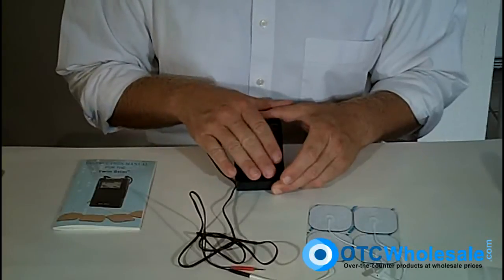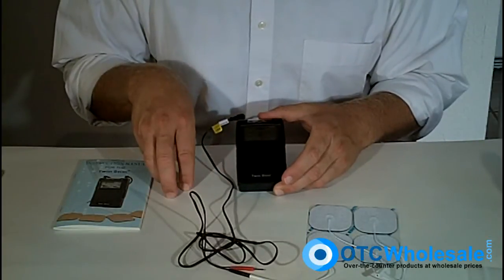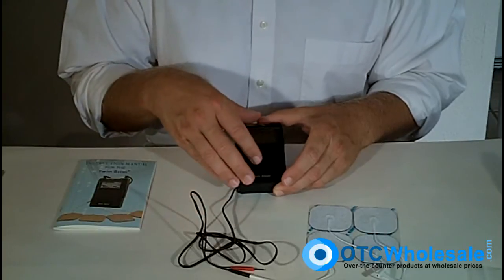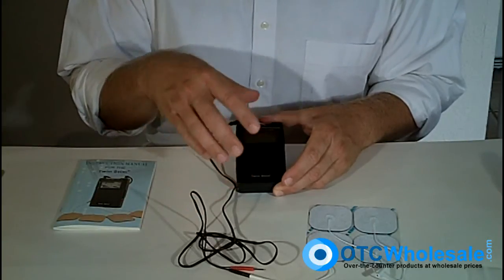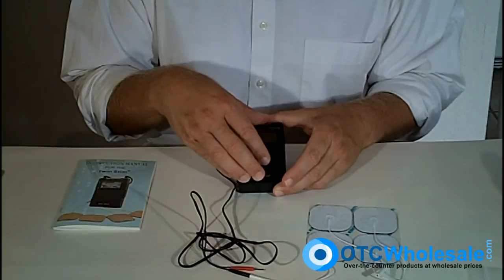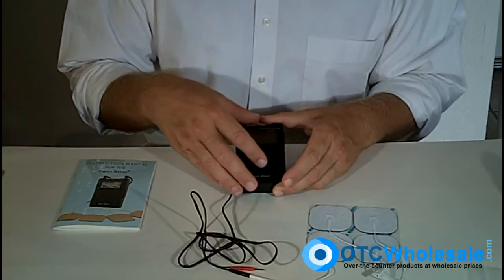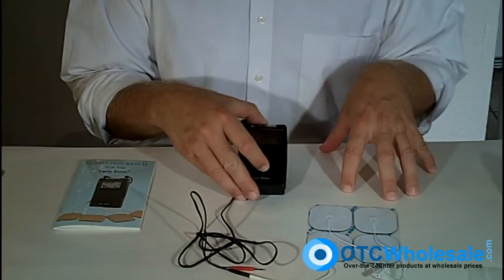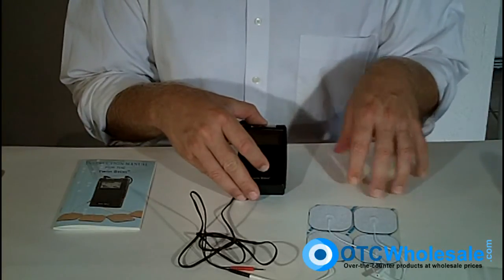This is part of a family of units. There's the 3000 — a three-mode TENS unit; the 7000 — a five-mode TENS unit; the Twin Stim — a combination unit with five modes of TENS and two modes of EMS or muscle stimulation; and then the 7500, which is a pure muscle stimulator unit.